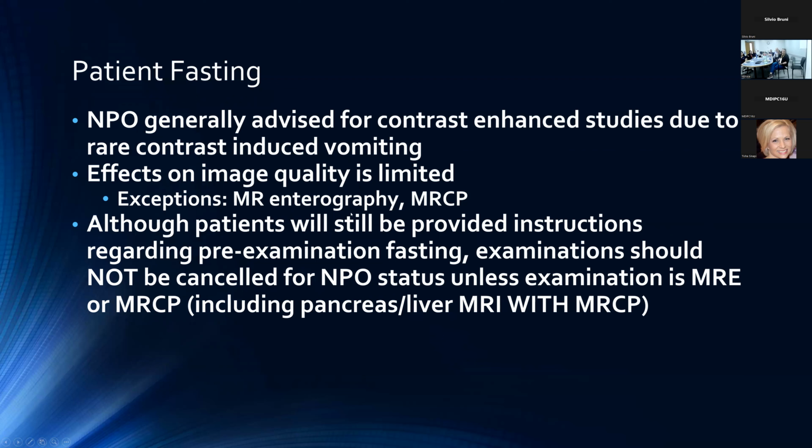The presence of some fluid or foodstuffs within the bowel will generally not limit image quality to any substantial degree, with the noted exceptions of, obviously, MR enterography, where the patient needs to be NPO, and MRCP, because it's that heavily T2 weighted imaging acquisition, having that additional fluid on board can make things much more challenging to interpret.